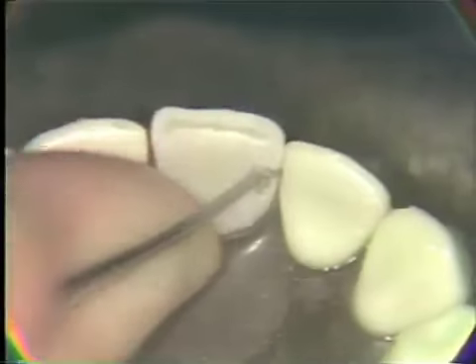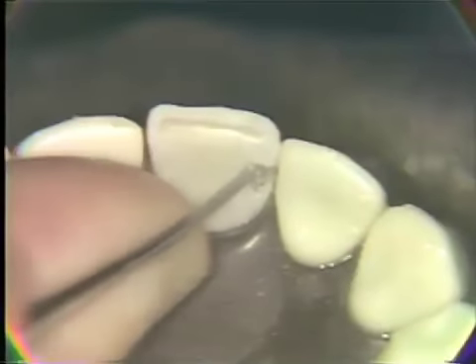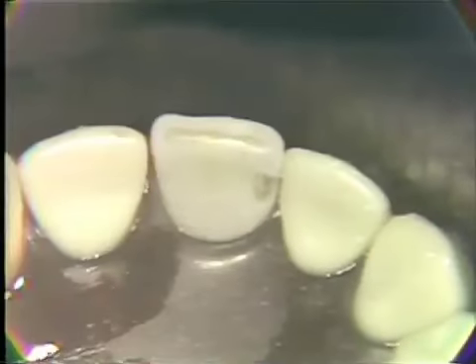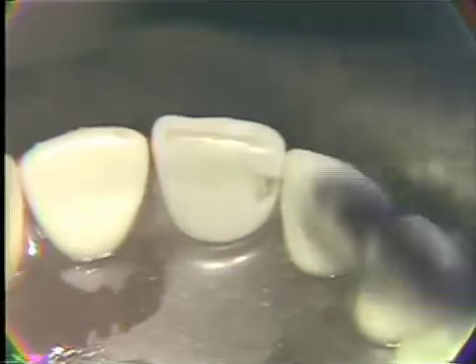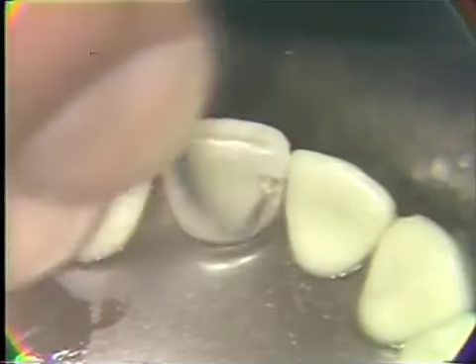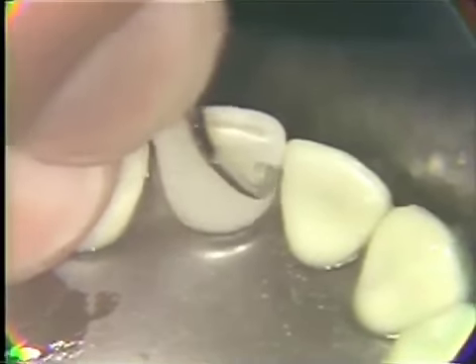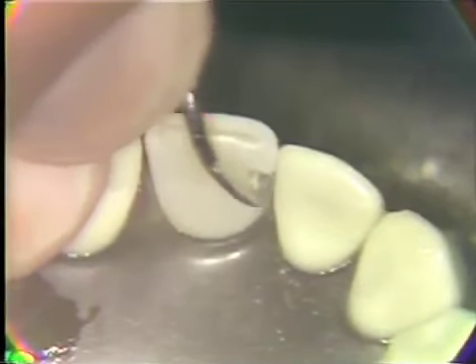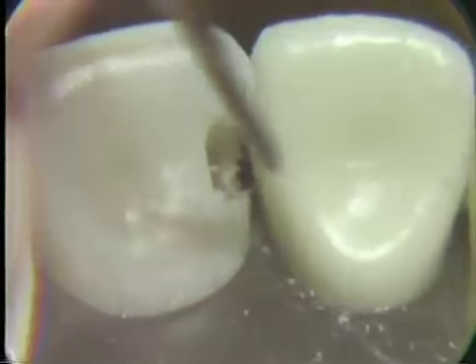Come back to the labial and incisal area with hand instruments. Cleaving that away again first with the Wedelstaedt and then moving to the hatchet to work the incisal and labial wall to gain some smoothness to this area.